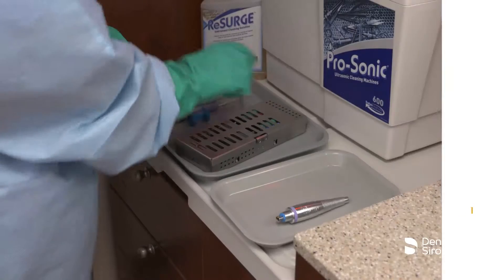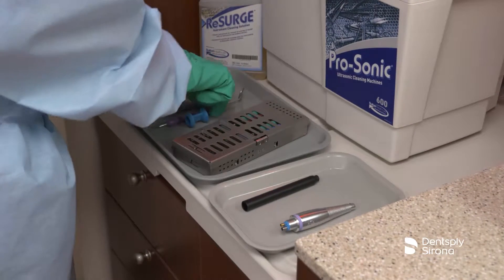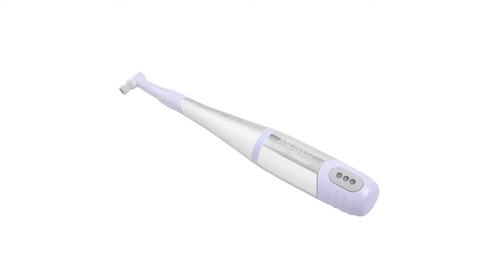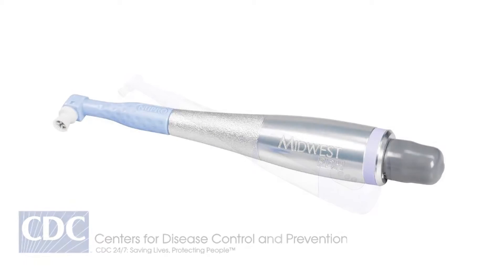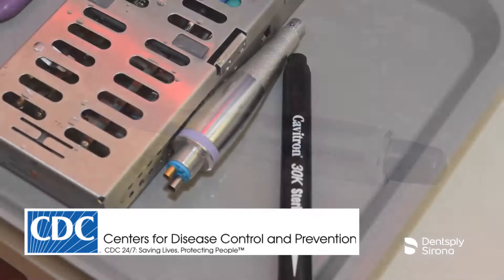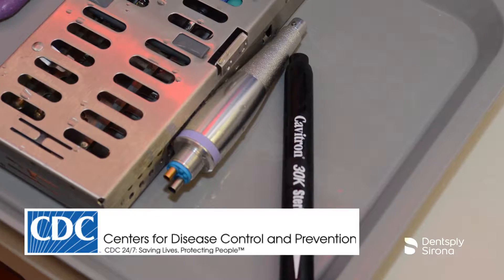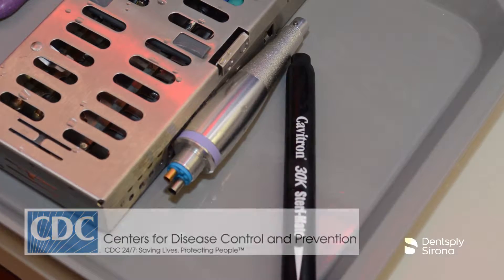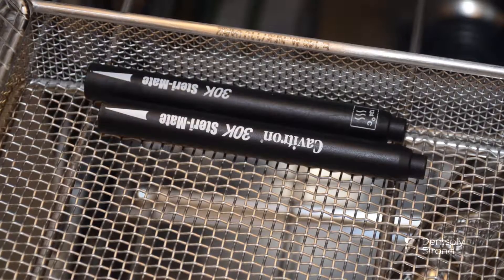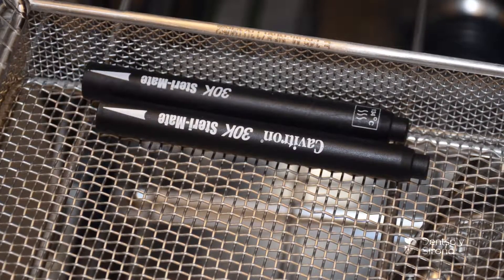Various types of handpieces are utilized daily in dentistry, and all require different care to maintain the life of the handpiece. The CDC's recommended guidelines for reprocessing of handpieces requires heat sterilization methods to sterilize handpieces and all devices that attach to air or water lines. It is important to follow the manufacturer's recommendations for cleaning, lubrication, and sterilization of handpieces being used.